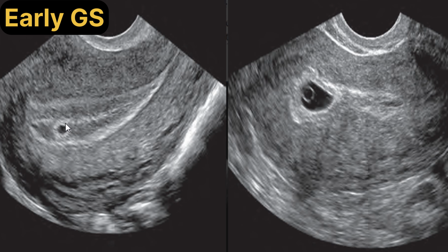In the specific settings in which the pregnancy test results are positive, there are no ultrasound signs of ectopic pregnancy, and a round, small, fluid-filled collection with a well-defined echogenic rim is seen immediately adjacent to the uterine cavity. This fluid-filled collection is likely to be an intrauterine gestational sac, even though it is too early to see a yolk sac or the embryo. Now here we can see a yolk sac within the gestational sac.